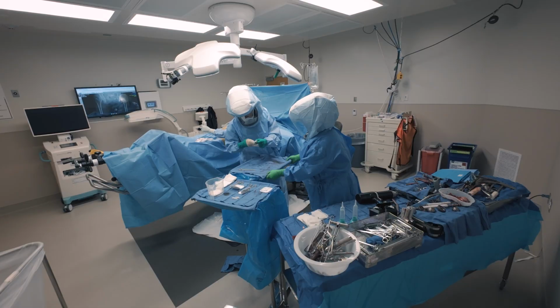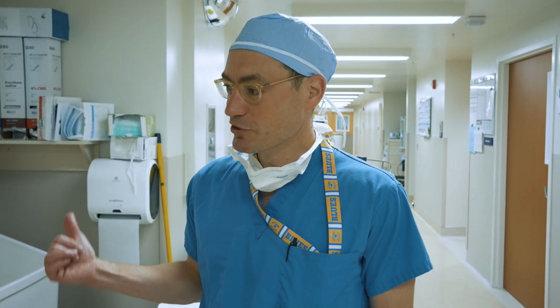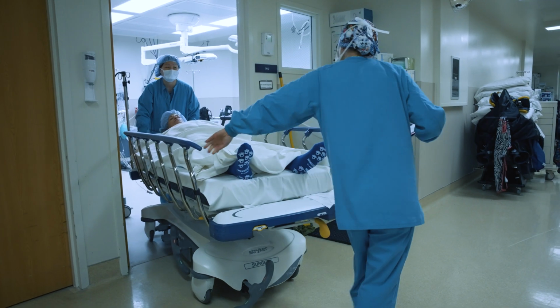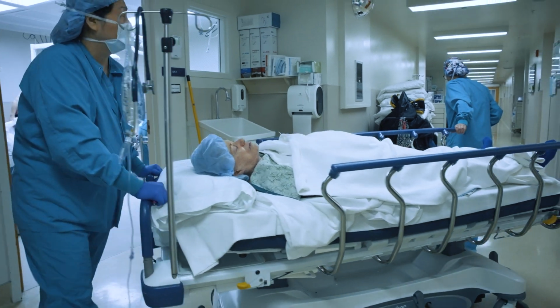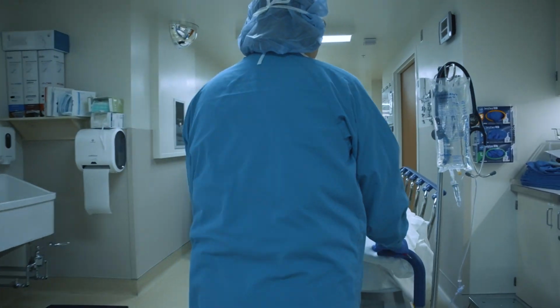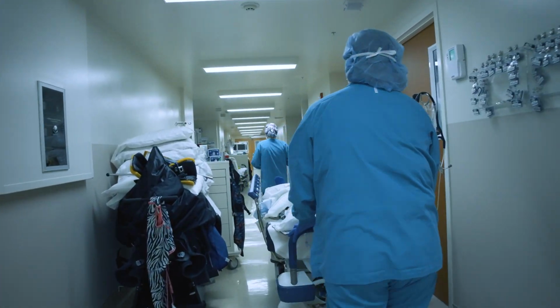Once the legs are awake enough, we'll get her up out of bed. She'll use a walker and take her first few steps on the brand new hip. So it's pretty exciting. We'll have a physical therapist work with her after that. She'll learn how to climb some stairs even. And then once she's feeling really safe and we're all feeling safe that she's safely getting around and everybody's comfortable, she's ready to go through some discharge instructions and she'll go home.